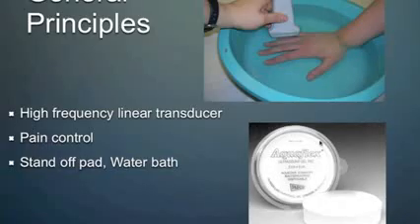You could also use a standoff pad such as the one you see here. There are commercially available standoff pads where you just place the probe on top of the standoff pad, and you place the standoff pad on the area of interest. Sometimes what happens is the natural focal point of the transducer is just too far away, deeper than where we're trying to insonate. So this happens with very superficial structures, such as on the finger, as we just saw.